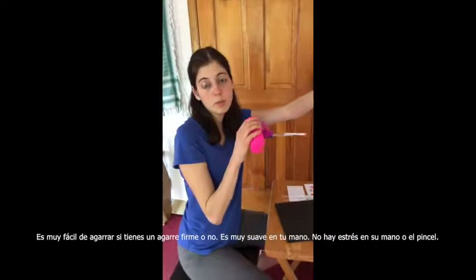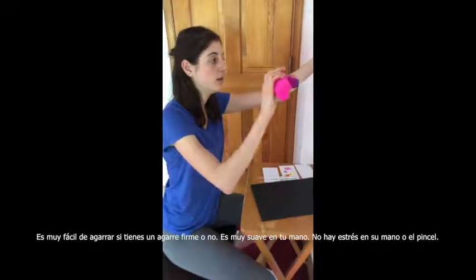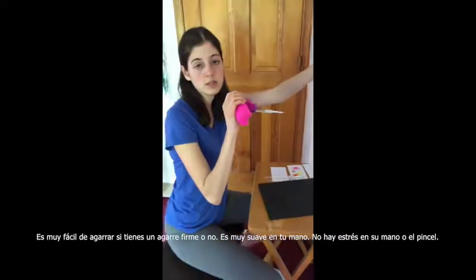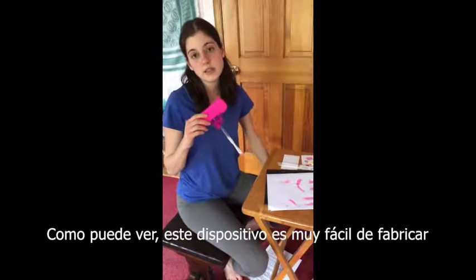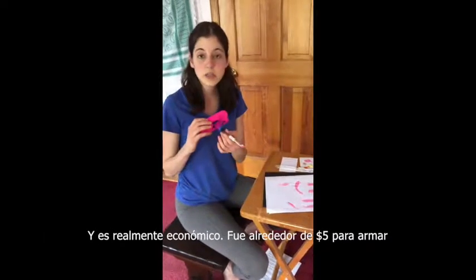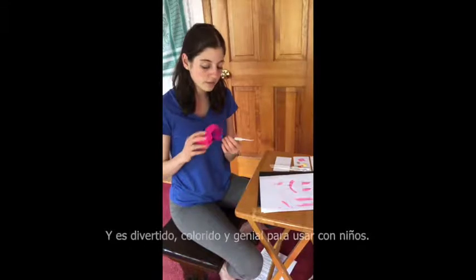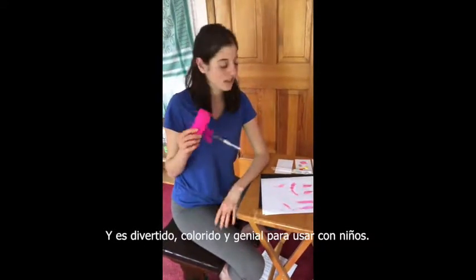It's very easy to grip whether you have a tight grip or not — very soft on your hand with no stress on the hand or the paintbrush. As you can see, this device is really easy to make, was very inexpensive at about five dollars all together, and it's fun, colorful, and great for use with kids.